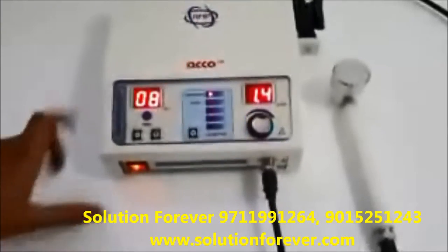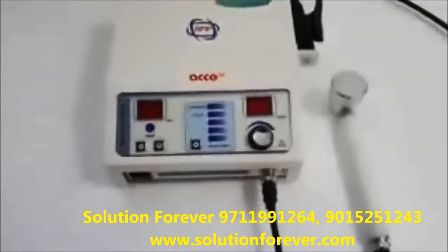After treatment is completed, switch off the machine. Demo is completed. Thank you.